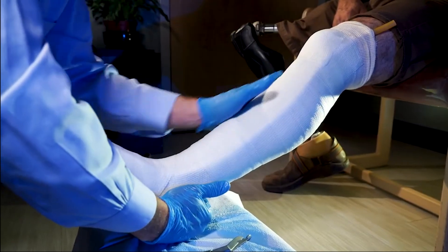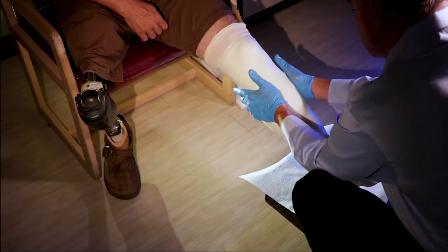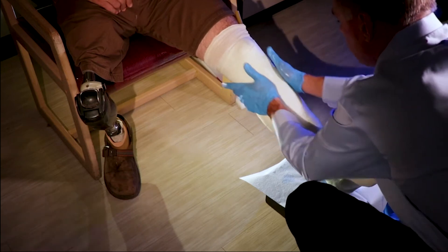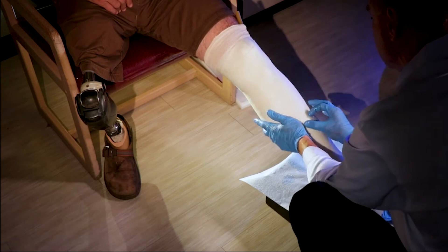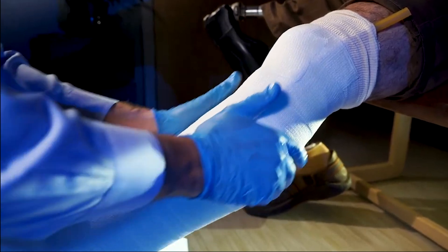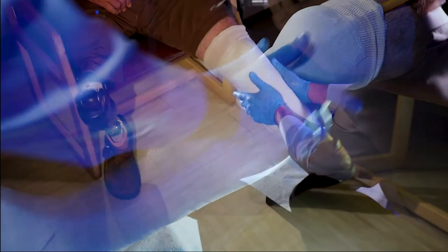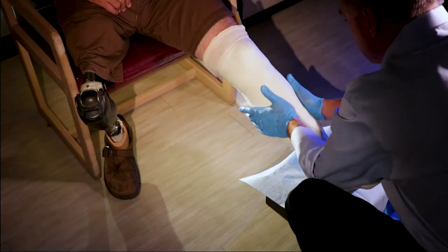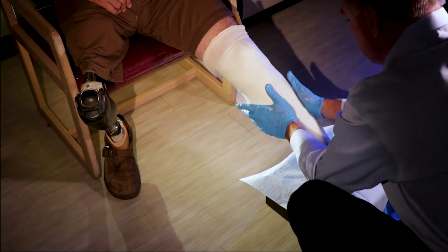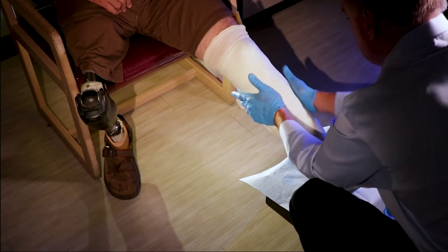As the fiberglass starts to set, I'm blending in my medial flare. I also apply some pre-tibial pressure — I squeeze ML in order to create relief down the tibia. This works very well with both the PTB upper section and the anterior shell. You can see that as I squeeze the fiberglass as it's setting, it creates relief down my anterior tibia, and yet I'm still maintaining my medial flare and applying pre-tibial pressure.